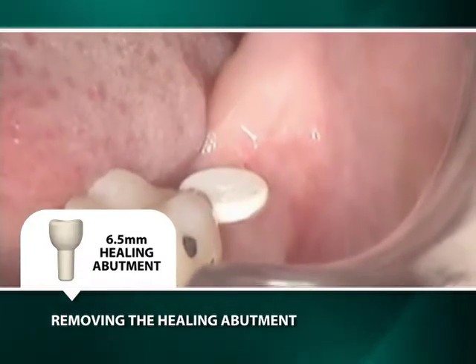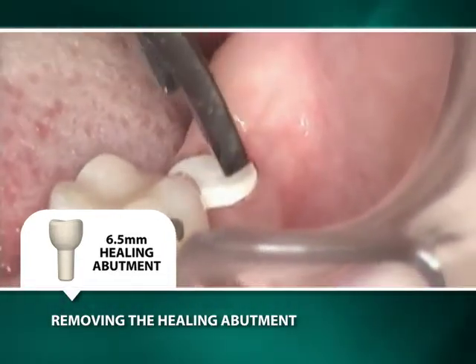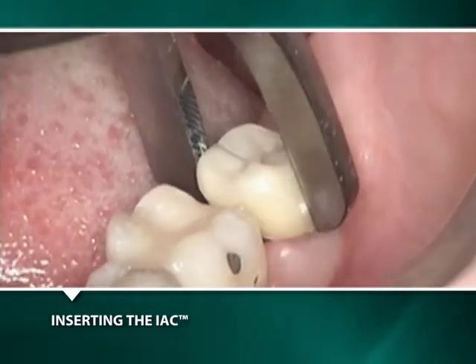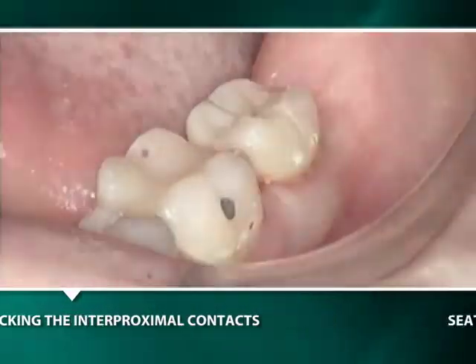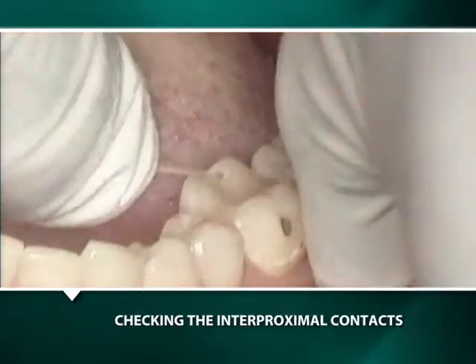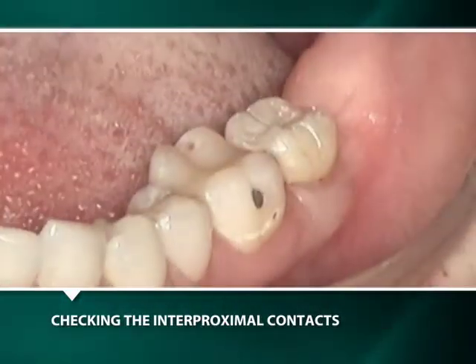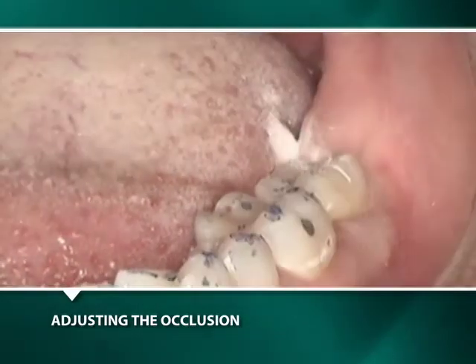After the laboratory fabrication of the integrated abutment crown — the IAC — the 6.5 mm wide healing abutment is removed with pliers for the initial insertion of the IAC. The well of the implant is cleaned with a cotton swab and the post of the IAC is cleaned with an alcohol wipe prior to its insertion. Initial seating is achieved with finger pressure prior to the evaluation of the interproximal contact with dental floss. More definitive seating is achieved by having the patient apply occlusal pressure onto a cotton swab. Since the interproximal contact is slightly too tight, it is relieved by the use of an abrasive strip prior to the IAC's definitive seating with occlusal pressure. The occlusion is evaluated and a slight sliding contact on the distal buccal cusp is relieved to complete the prosthetic IAC restoration.